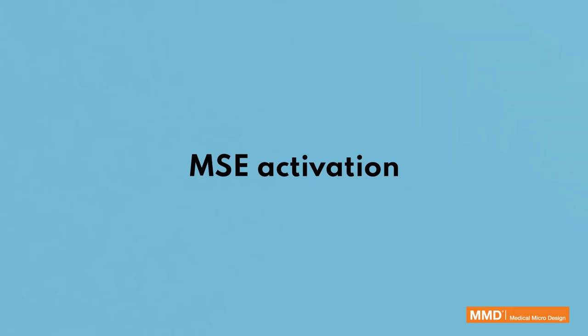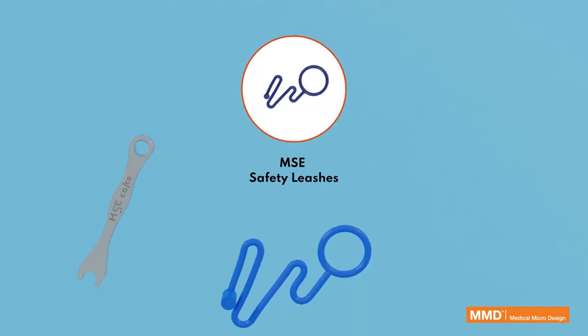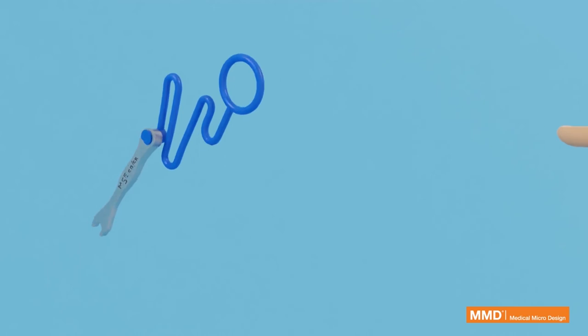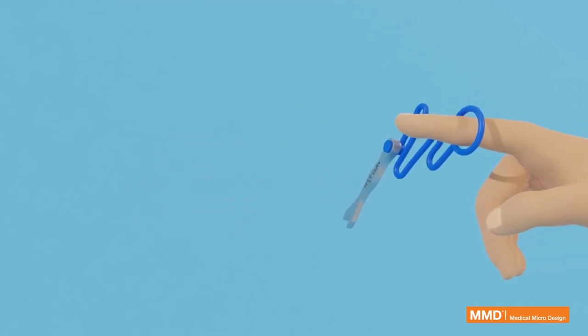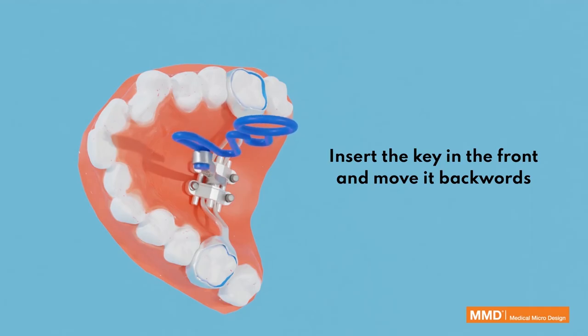MSE activation. MSE 2 activation spanner key, long. MSE safety leashes. Insert the key in the front and move it backwards.